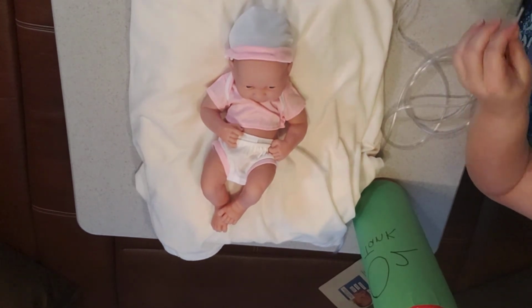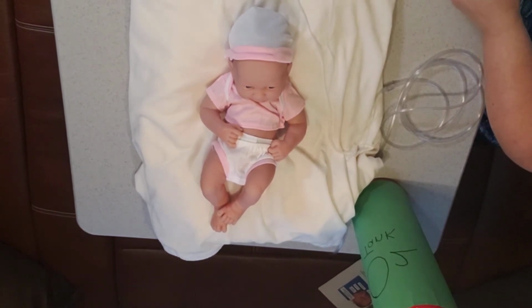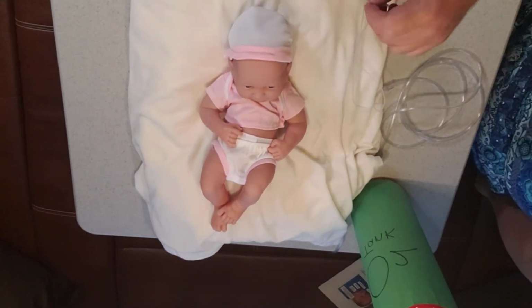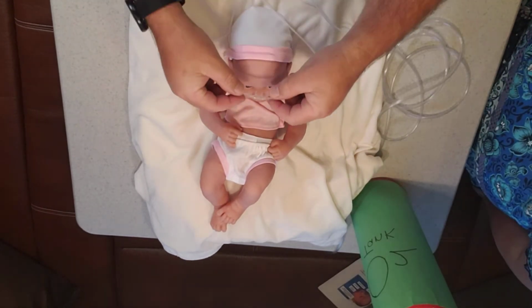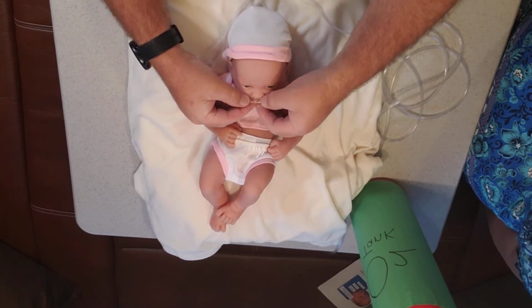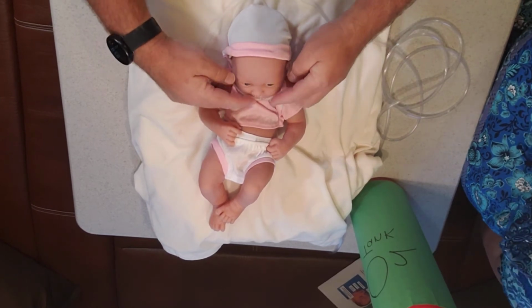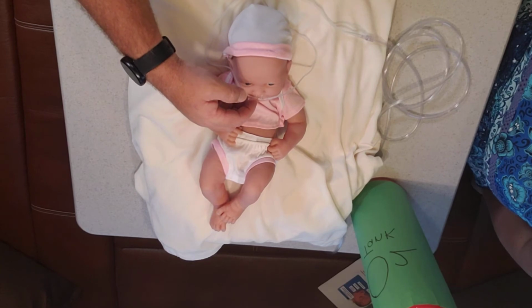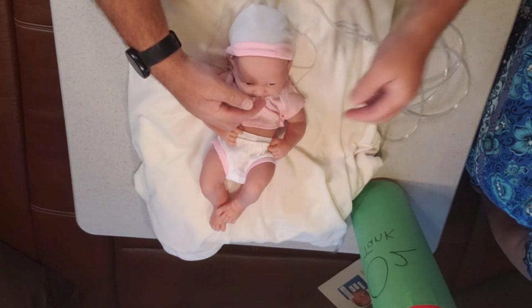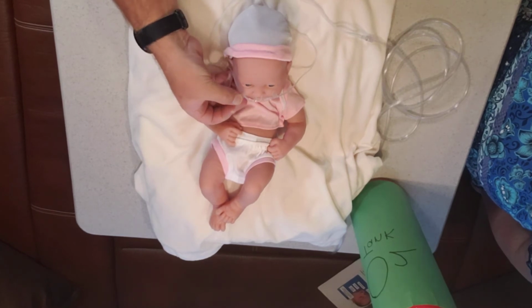Okay, great. Well, I'm going to let you go ahead and practice with the mannequin. Okay. Do the simulation. All right, Bethany, you cute little young miss. She is super cute. Put the nasal cannula in your nostrils. I'm making sure the prongs are down. I'm going to insert it all the way, but without having this plastic piece touch her nostrils. So I'm just going to hold that in place while I put the skin sensitive tape on there. Tape it in place. Tape the other side in place.